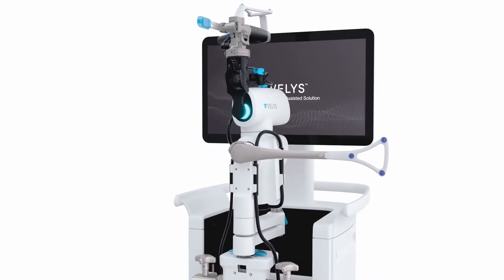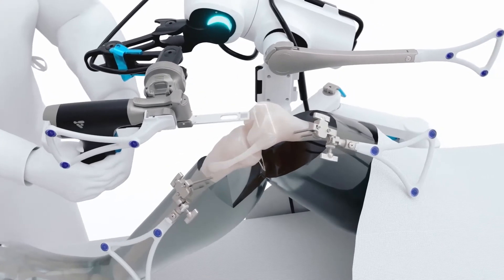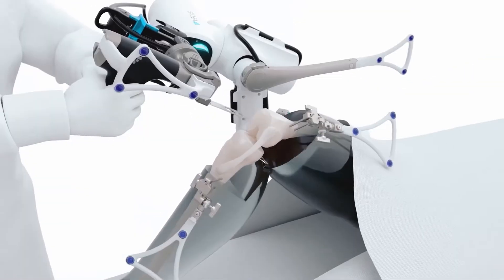With the Velys robotic-assisted solution, surgeons are in control during the entire procedure. The device does not move or operate on its own.